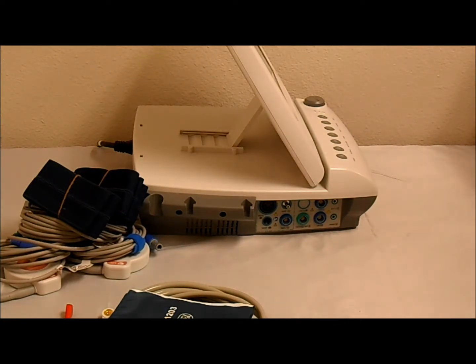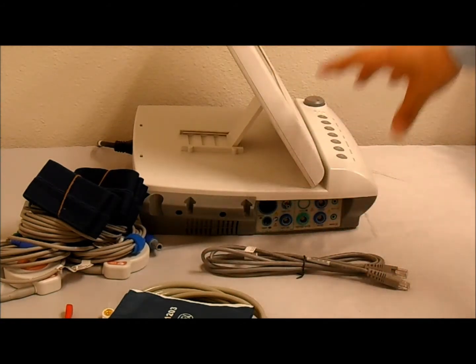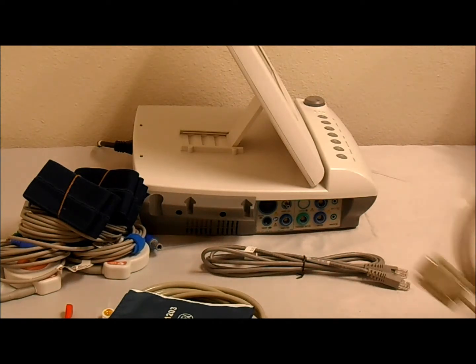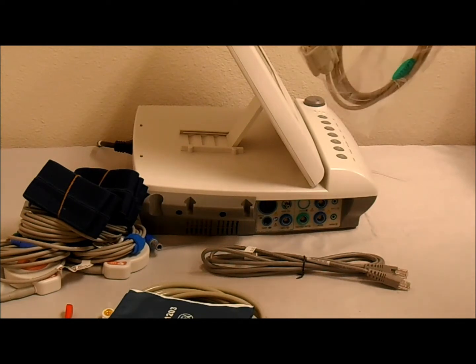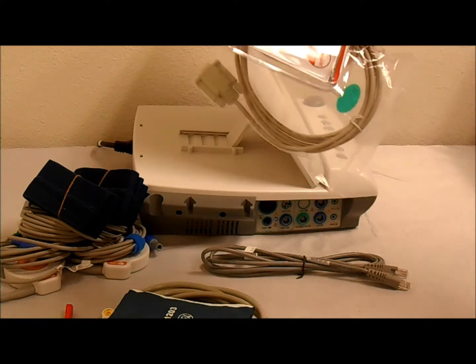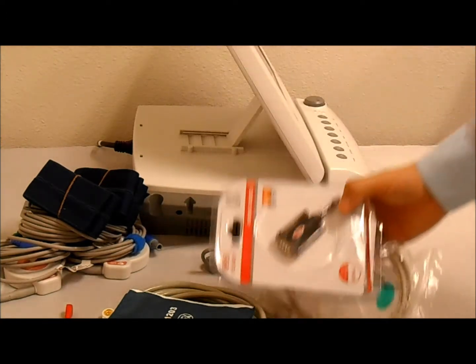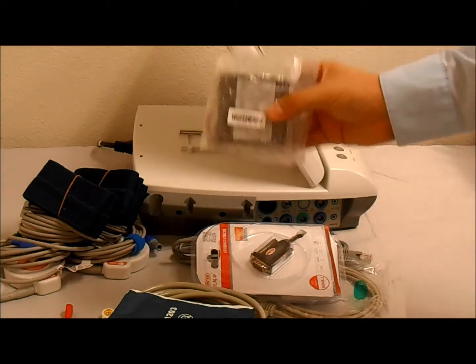And outside of those core transducers and accessories, we also have cables for data transfer. So we have an Ethernet cable for transferring data to a computer, and we have an RS-232 cable. Most modern computers don't have RS-232 ports, and that's why an RS-232 to USB adapter is provided. And for power, we have the AC power cord, of course, and your battery.